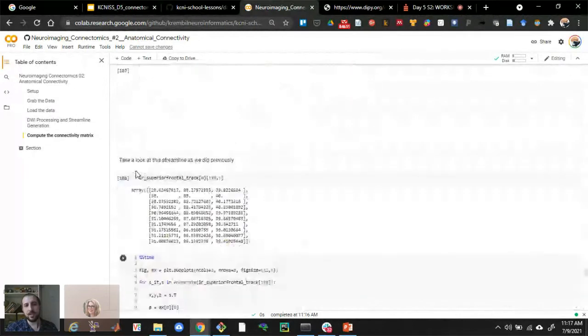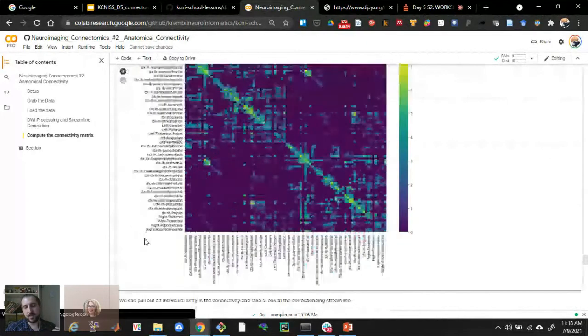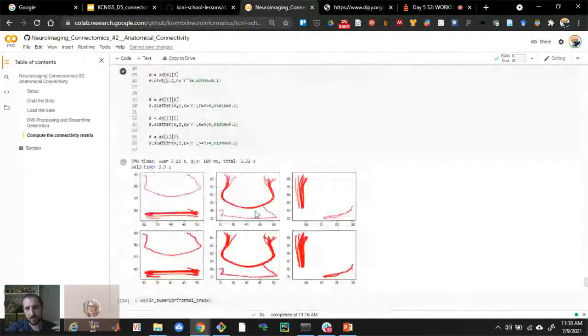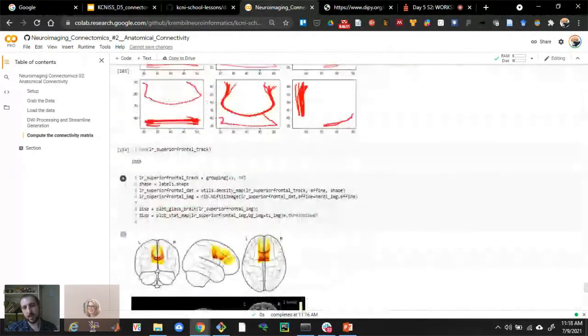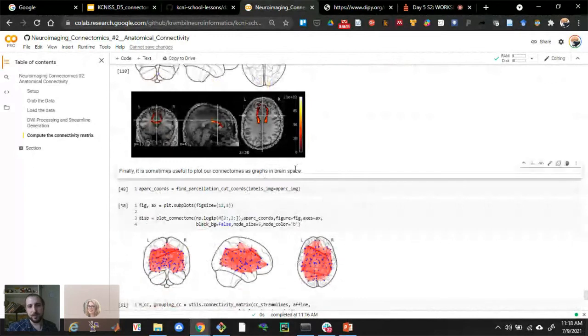Just having the adjacency matrix where you say, oh, A is connected to B, that's insufficient. If I know A is connected to B, and I think maybe there's a lesion here, well, if I don't know the physical route that A takes to B, then I don't know if my lesion is going to be touching or impacting the physical connection, right? So I think there's value in being able to move between your abstracted connectivity representation and your original three-dimensional streamline volume information, particularly when you have some complementary geometrically defined information that you might want to bring into your analysis.